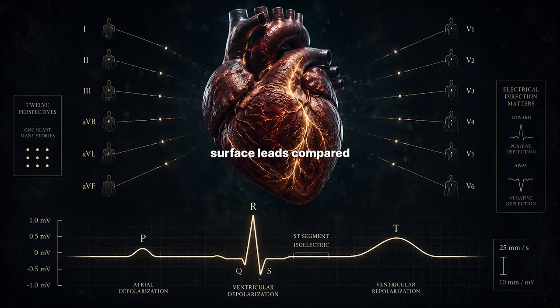Travel, surface leads compared, and the paper ends. The beat had left a trace, not of the blood it moved, but of the electricity.